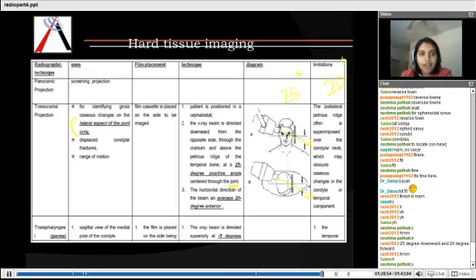Yeah. Now, what it shows is the lateral aspect of the joint. Further, it may help in showing the displaced condylar fracture, and it also shows the range of motion. But the problem is that the ipsilateral petrous ridge is often superimposed over the condylar neck.